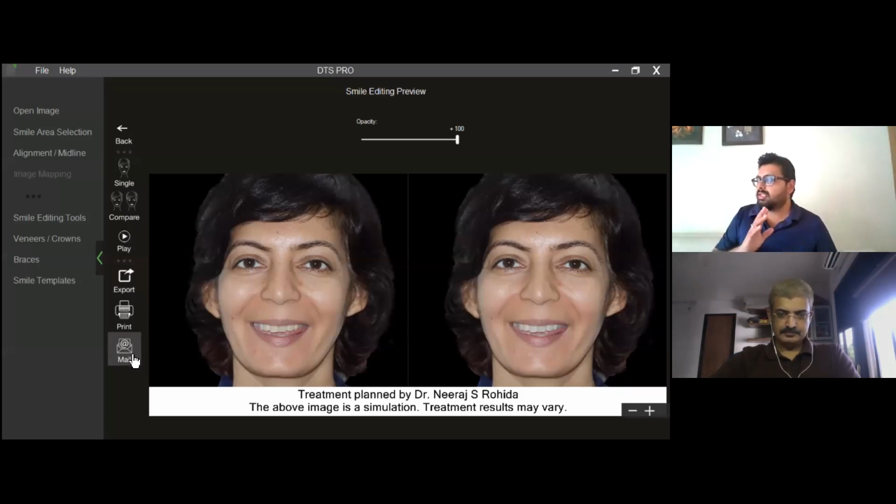So simulations typically, again, Dr. Christian Coachman's philosophy is show it to them on a big screen. Simulation is something which is not very well appreciated, I would not say not appreciated, very well appreciated on a mobile screen as opposed to maybe a 40-inch big screen in your consult area. It makes a world of a difference. I show it on a big screen, the image goes into the recycle bin after that.